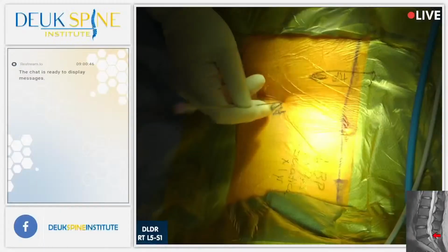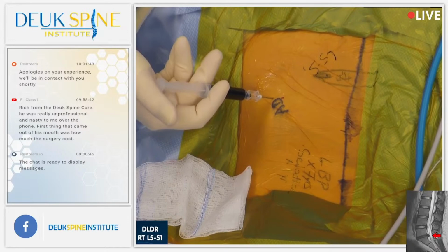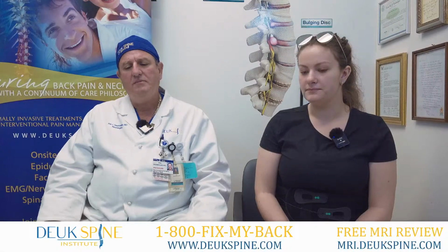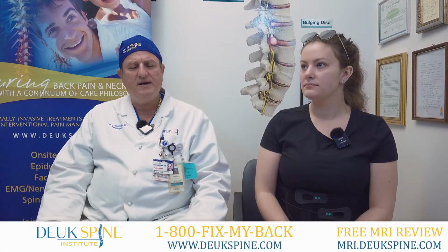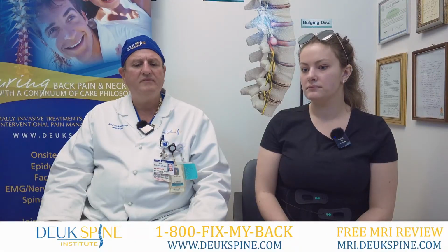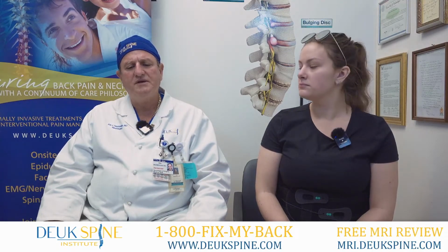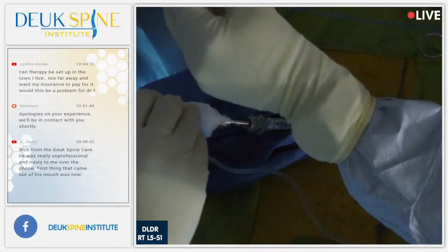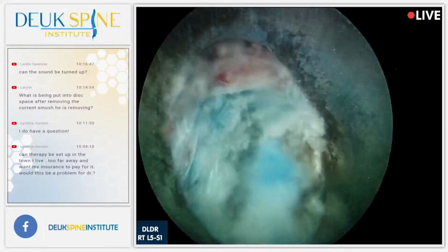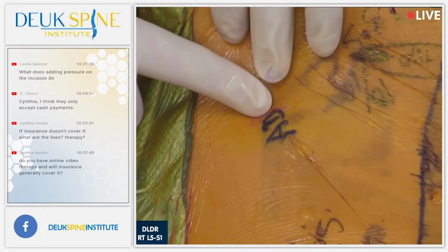So you can see in your surgery right here, we actually tested your L5-S1 disc with a discogram, which is a test done to verify that that disc is indeed causing your back pain. And when we tested it, we asked you how bad it was, and you said 10 out of 10 pain. And I said, is that your typical pain you get every day? And you said, yes, it is. So we verified the source of your pain was the L5-S1, and you can see the laser was used to clean the tear endoscopically. Your incision was only a quarter inch, and there's no need for fusion or metal or artificial discs. This surgery replaces fusion and artificial discs.